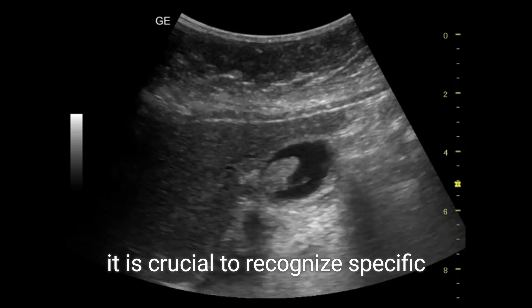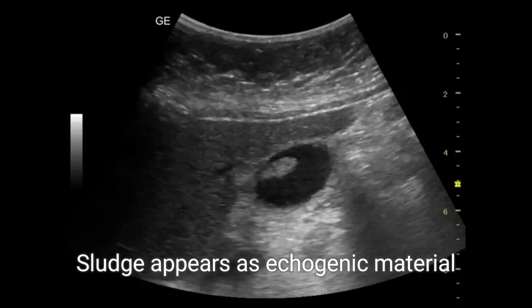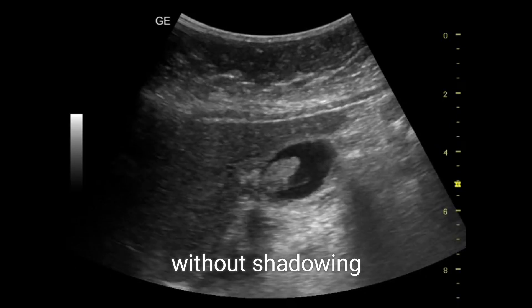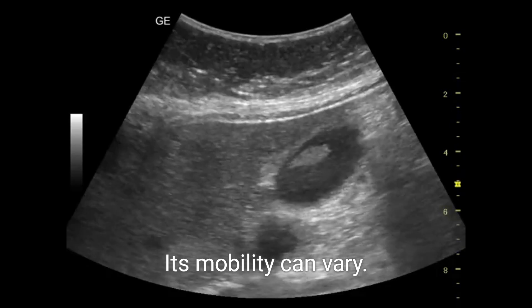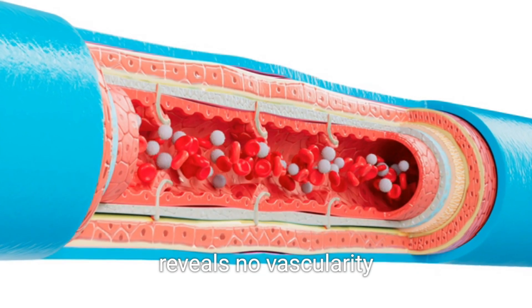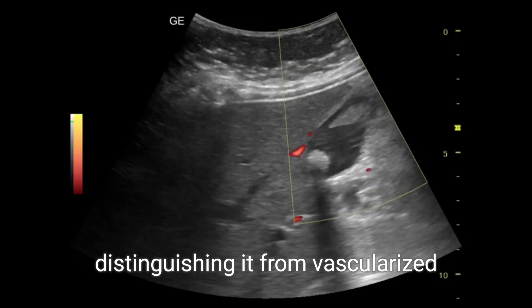It is crucial to recognize specific ultrasound characteristics. Sludge appears as echogenic material without shadowing and may have irregular contours. Its mobility can vary. Importantly, color Doppler imaging reveals no vascularity in sludge.